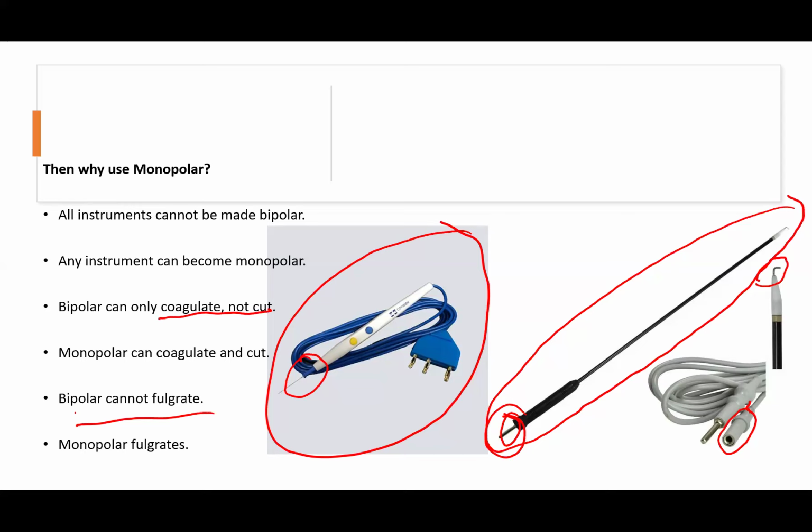You see, this monopolar instrument you are seeing is very versatile. It can be used for several procedures. So what you need to do is to understand how it can cause complications so that you can use it well. When you use it properly, you may find that you have little need for highly expensive gadgets during your procedures.